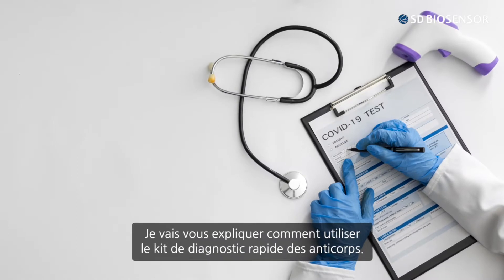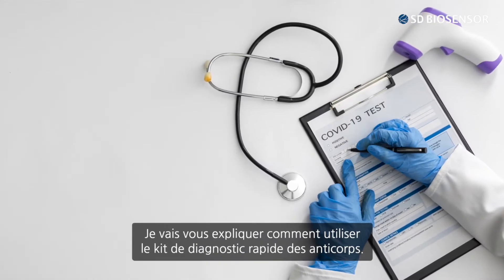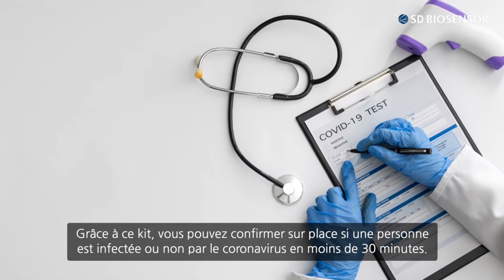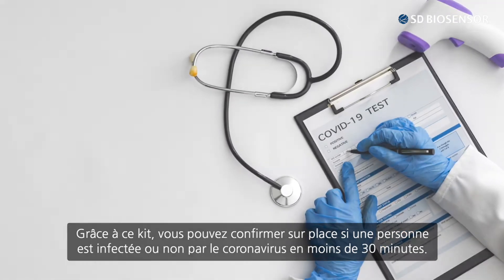I will be informing you on how to use the Quick Antigen Diagnosis Kit. With it, you can confirm on the spot whether someone is infected with COVID-19 or not in less than 30 minutes.